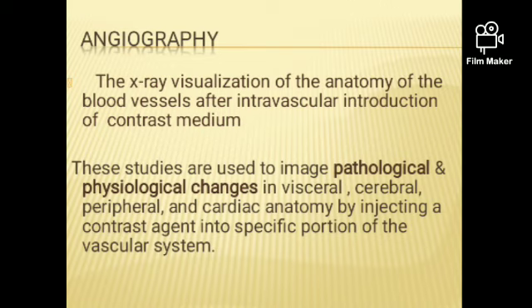I'll give you a small example. You have a white cloth and you have drawn a flower, but will this flower be visible to you right now? No. The same is our soft tissue. Once you put the red color, you can see the petals of the flower. Once you put the yellow color, you can see the middle portion of the flower, and once you put the green, you see the leaf, and that makes a perfect diagram on the white cloth. The same is angiography, where we inject the contrast media and we see only the blood vessels, and we are going to highlight them.